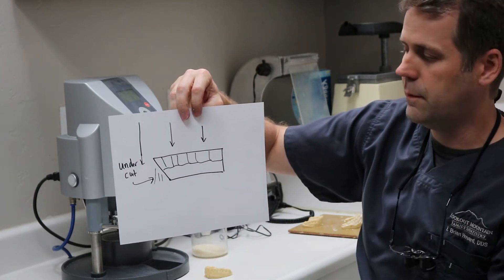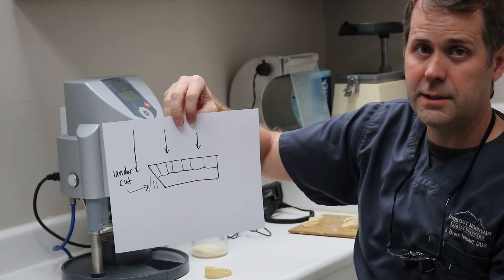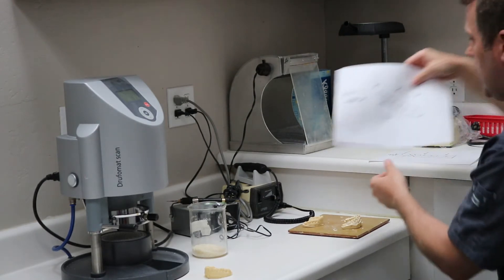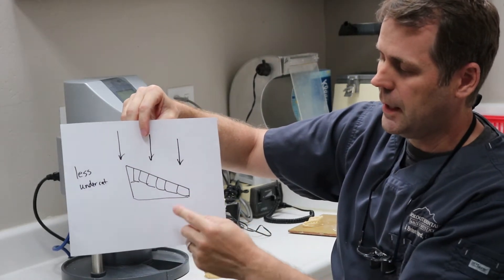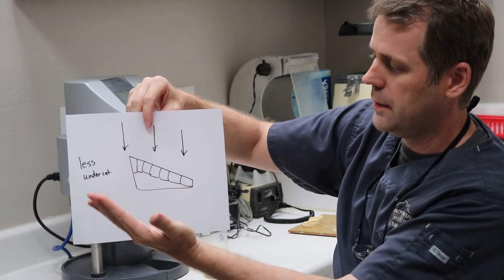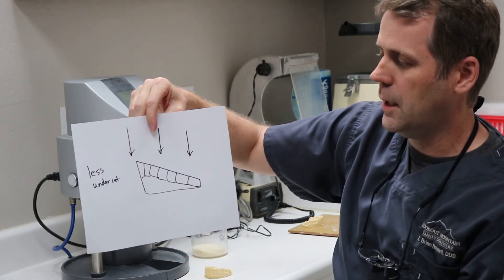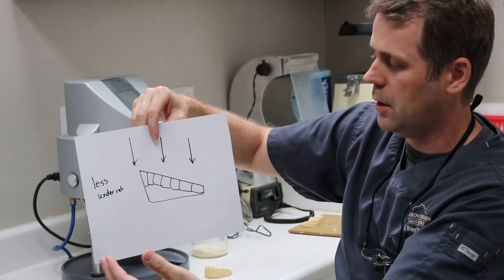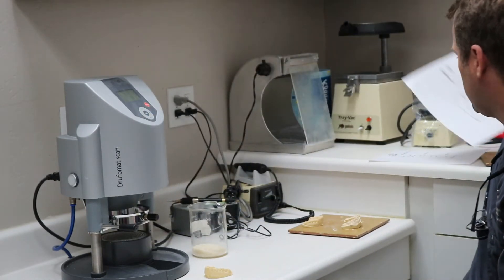So what I do a lot of times to avoid getting that undercut and to allow the material to come down and adapt well into that anterior region is I'll trim it more at an angle. So you can see I've had the occlusal plane coming down at an angle, just at the back molars. What that does is lift those teeth more straight up and down, so you avoid that undercut. And when you suck down the material, it doesn't have to work very hard or stretch very hard to get into this anterior region.